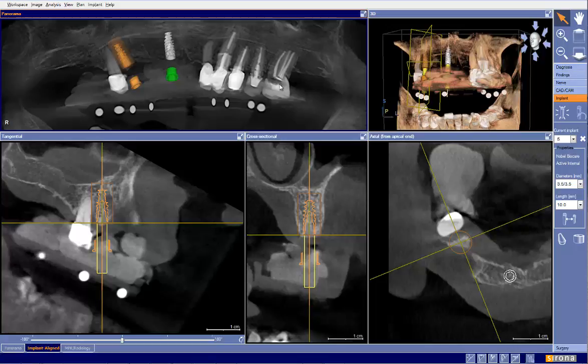But I would do that just from a perspective of possibly being able to design teeth and being able to bring in data. And that leads me to my next step. In this particular case, I would be a bit uncomfortable moving forward of planning this case without a diagnostic wax up and a diagnostic radiographic scanning appliance. And the reason is especially with locators or long span bridges, even more so with locators, angulation and location of the implant becomes significantly more important.